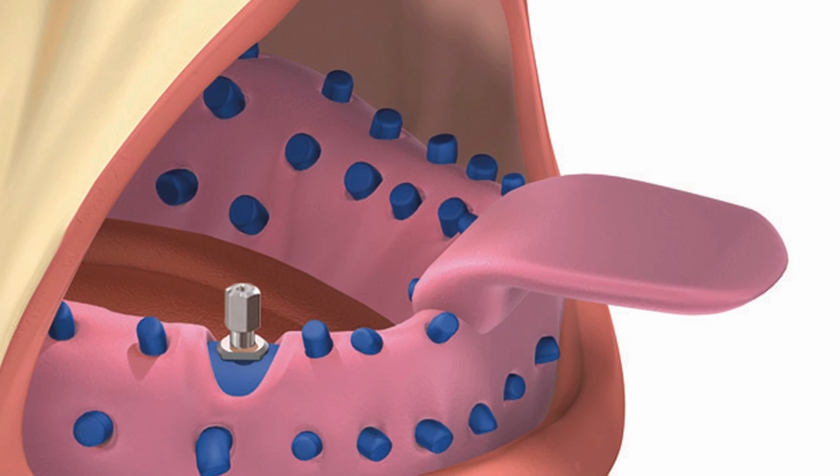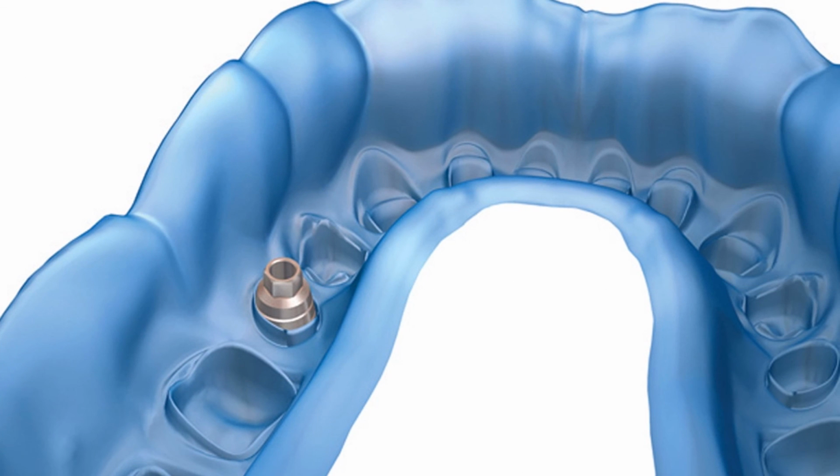Then it's just a matter of getting the impression material inside the impression tray and seating it down. As you see in this picture here, you see why this is called open tray. That impression coping is open, and you can unscrew it once the material has set. You remove the whole thing as one piece, and boom, there you go. Accurate impression. You know exactly where that implant is from a three-dimensional perspective.